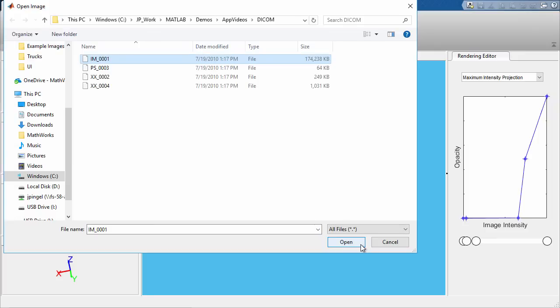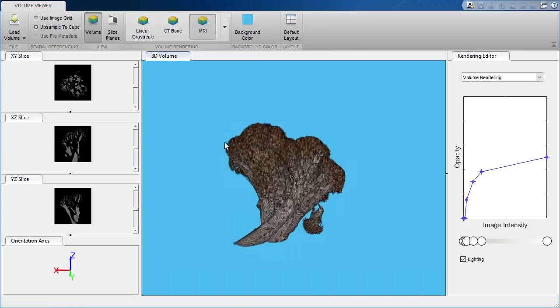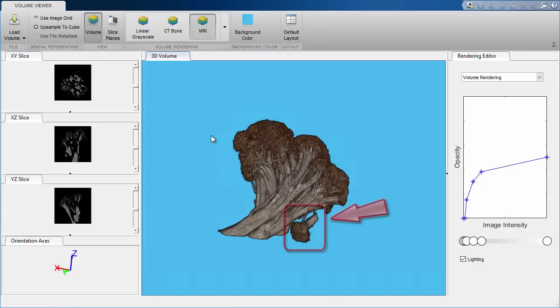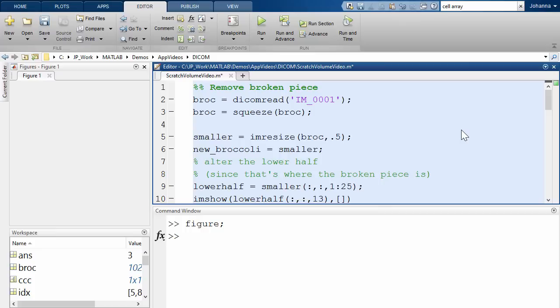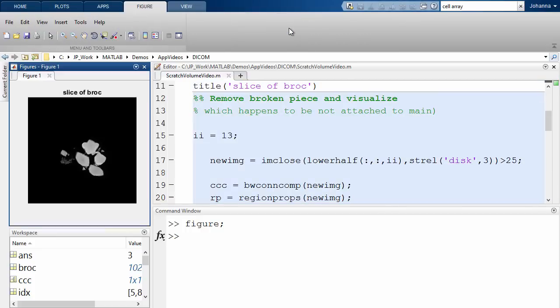So in this example, we see some broccoli. We want to segment out this broken part right here. So once we visualize this, we can go into MATLAB and decide to perform some 3D image processing on our data.